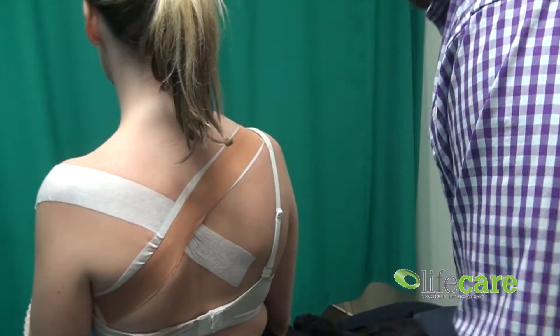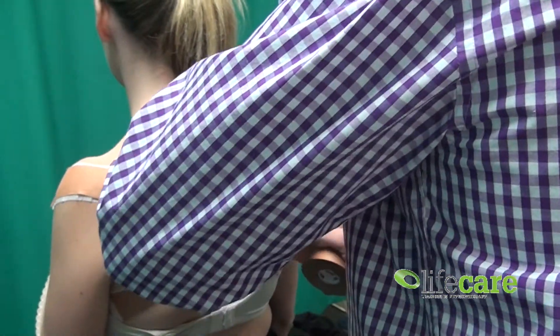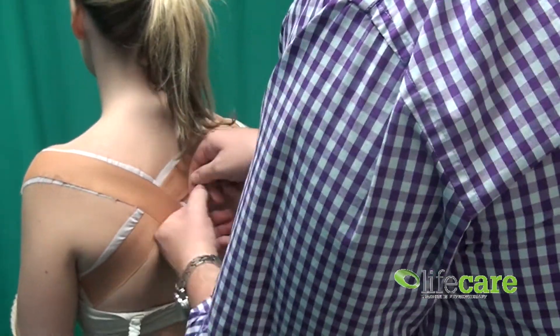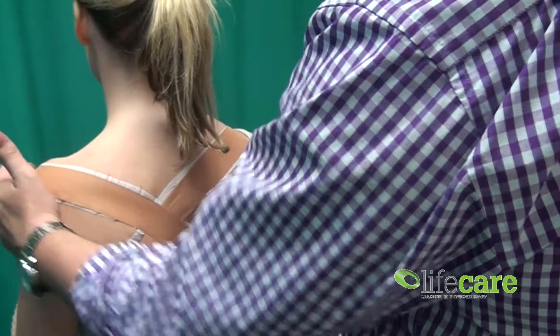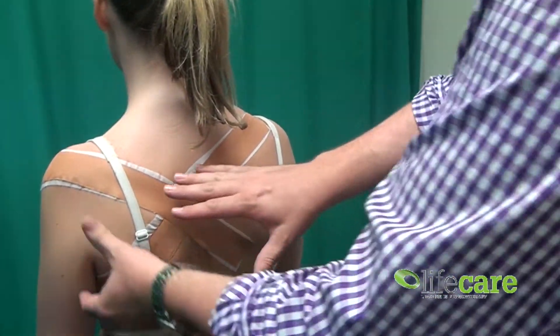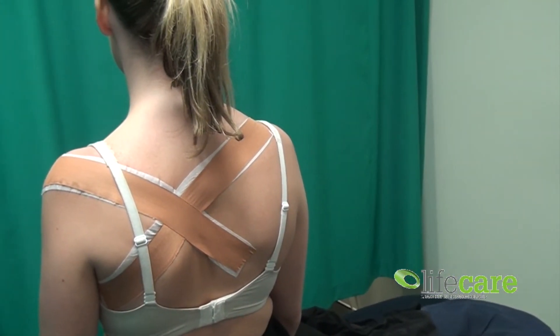So getting that lift in the shoulder. Then the second piece we're going to do is to actually hold the tape, draw it back, getting that little bit of a pinch on the skin, and laying down. So just allowing that scapular position to get set, and obviously working with exercises that Claire can do at home — which is to gently draw up and back. So that's this week's edition of Taping Tuesday. Have a wonderful week.